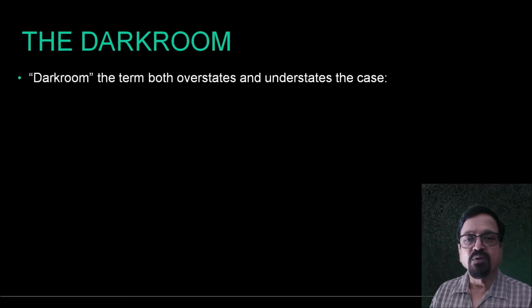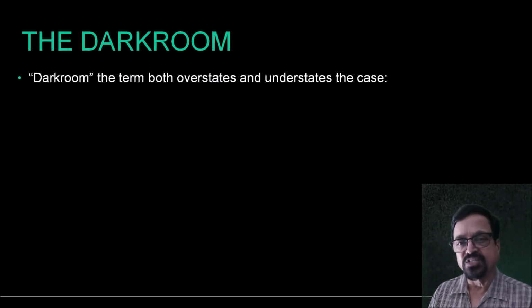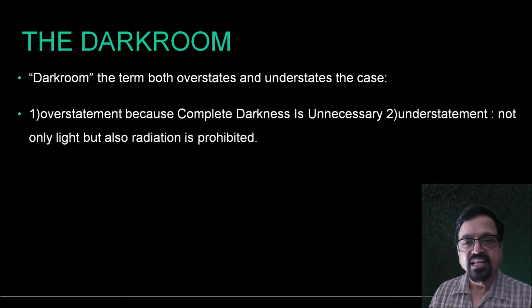Now, the word darkroom means both things, which either overstate or understate the case. Now let's see how it is. The overstatement, because complete darkness is unnecessary and complete darkness will not allow us to work in it. And two, understatement, since it is not only light but also radiation that is prohibited in a dark room.